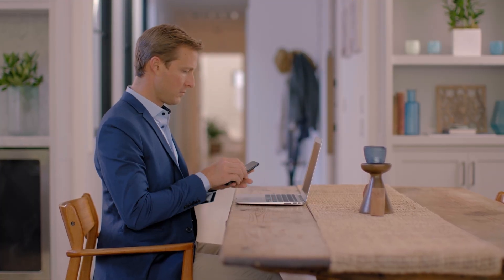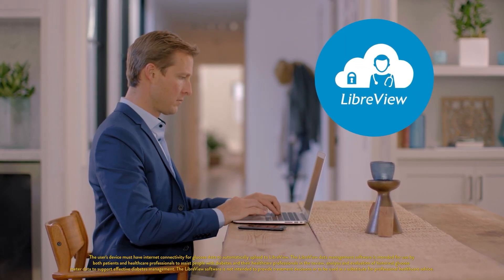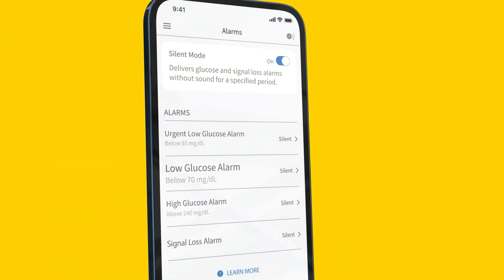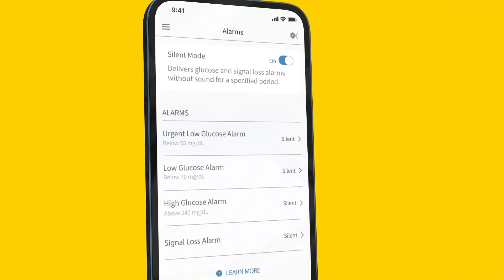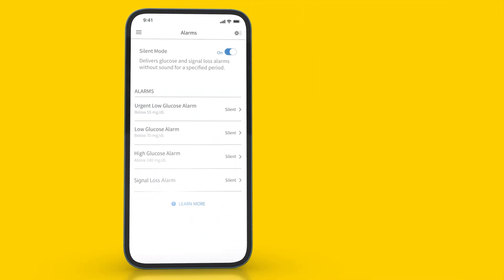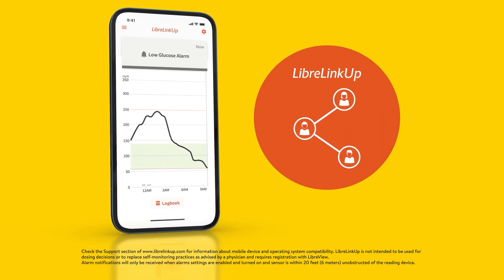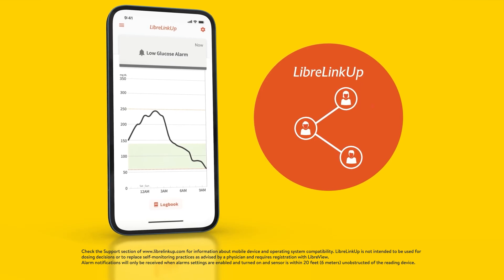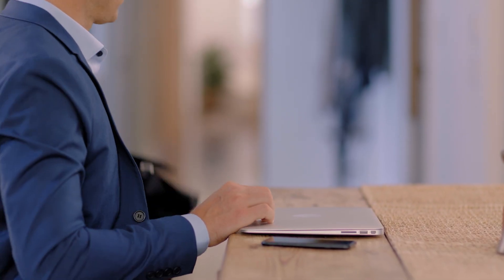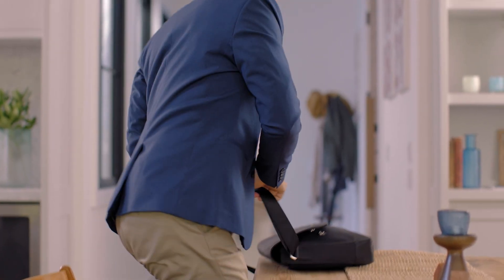Your glucose data automatically uploads from your phone into LibreView, making it easy to share your data with your diabetes management team. Turning the high glucose, low glucose, and signal loss alarms on is an optional feature, and personally I find them to be valuable in managing my diabetes. By having my alarms on, caregivers using the LibreLinkUp app who I've connected with can also receive a notification whenever I receive a glucose alarm. Having up-to-the-minute glucose alarms delivered right to my phone helps me respond quickly and better manage my diabetes.